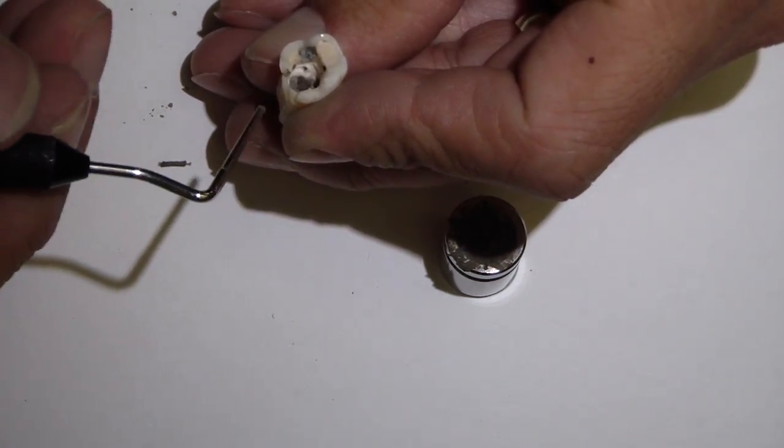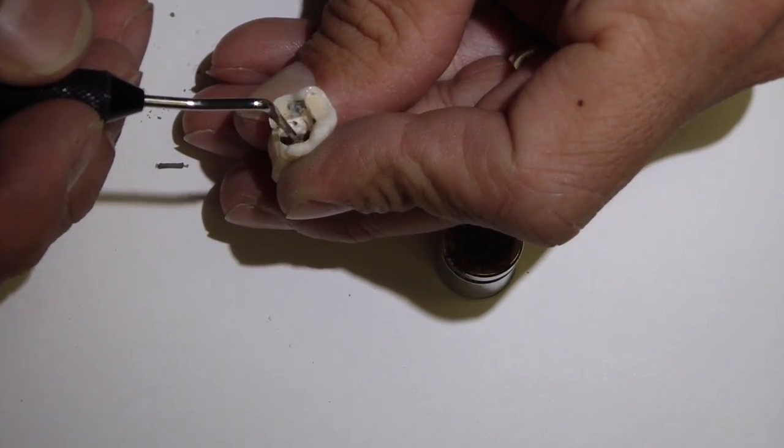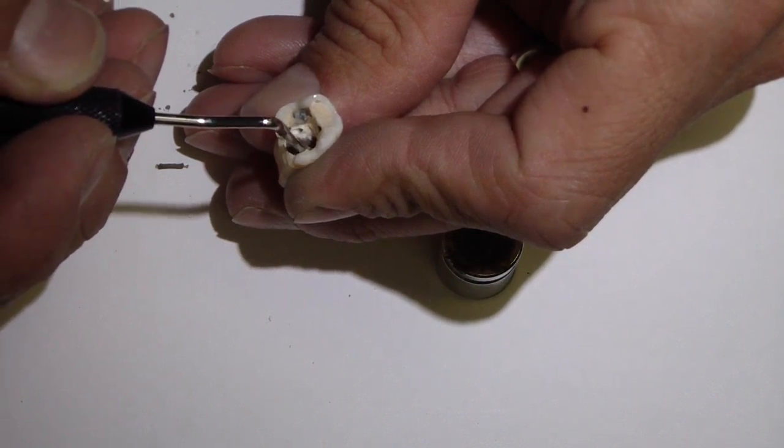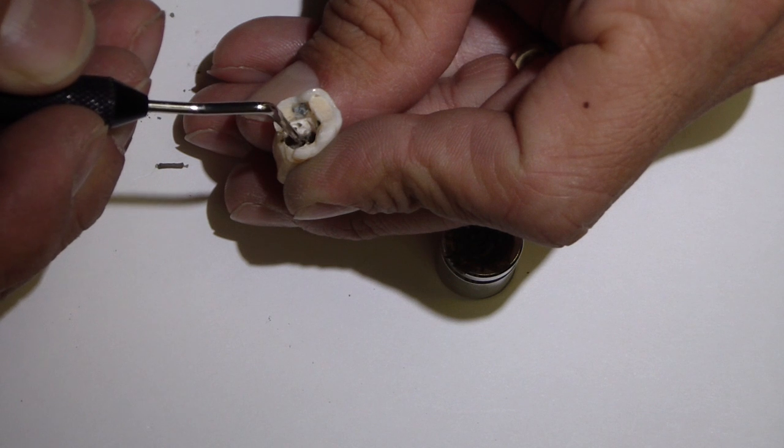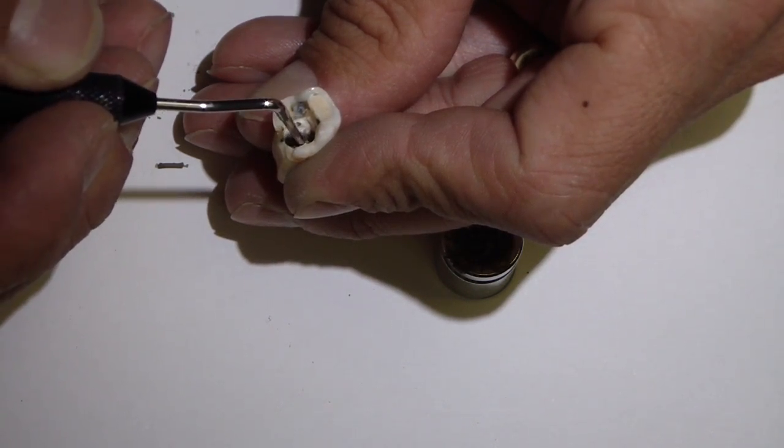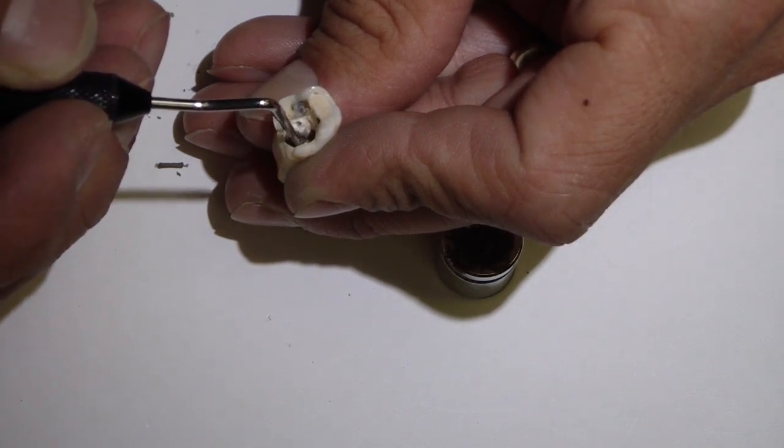Now take my condensing. And if you have ultrasonics, it's a good time to use ultrasonics to sort of place your packing instrument. Place your packing instrument, and then tap it with the ultrasonics. And then just sort of mix that around.